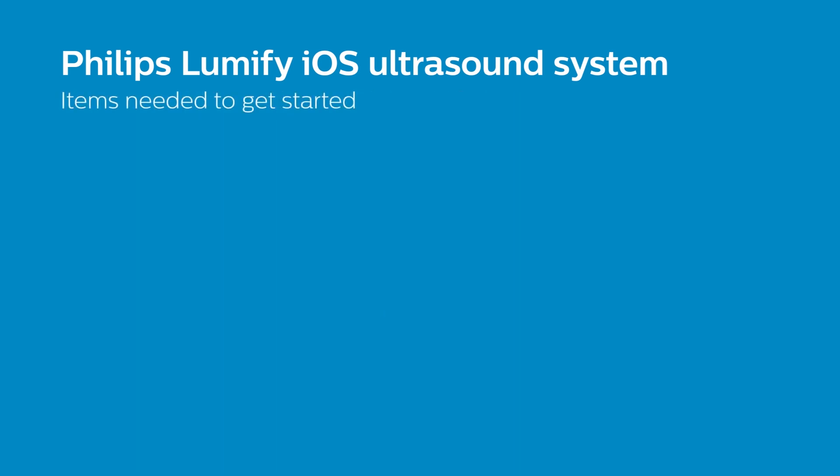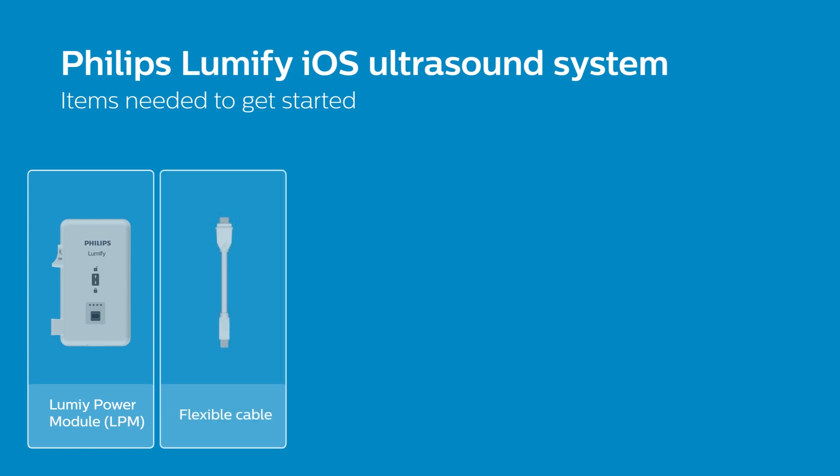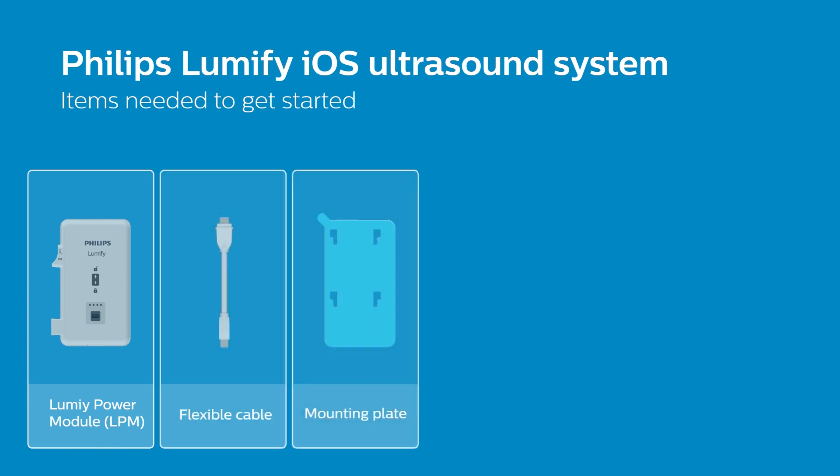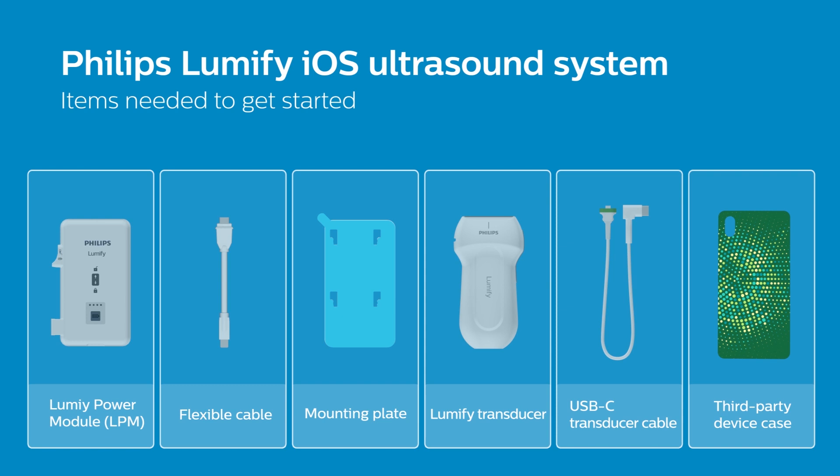Here are the items you will need to get started with the non-Philips case configuration: your Lumify power module, flexible cable, mounting plate, Lumify transducer with a USB-C cable, and your third-party device case.